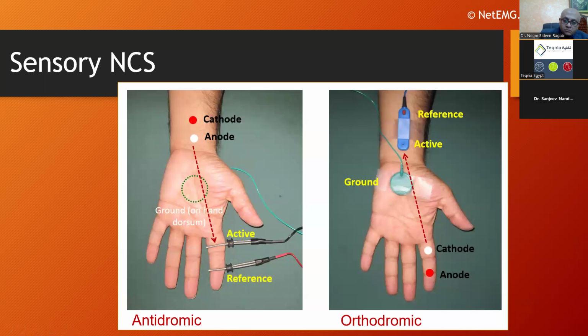You essentially break the nerve into two compartments of 7 centimeters and compare the conduction. Overall, the conduction is abnormal, but you can also see it is much slower here compared to here. Ernie Johnson has published this method, called 14-7. You can use that, and it is useful when there is also a superimposed polyneuropathy due to diabetes.